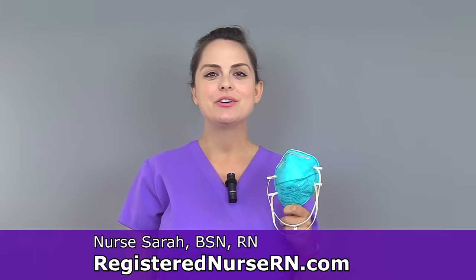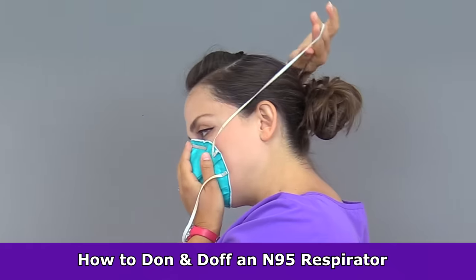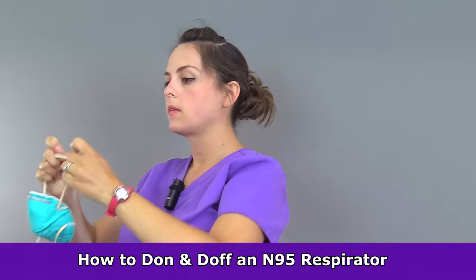Hey everyone, it's Sarah with RegisterNurseRN.com and in this video, I'm going to demonstrate how to put on and take off an N95 respirator.